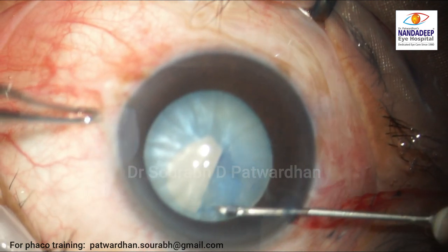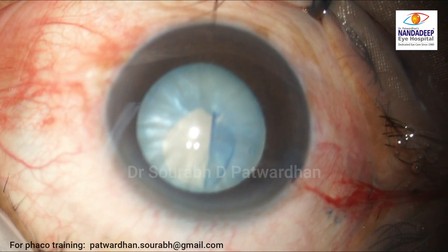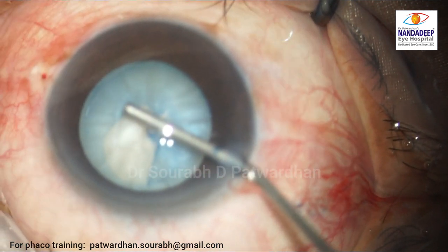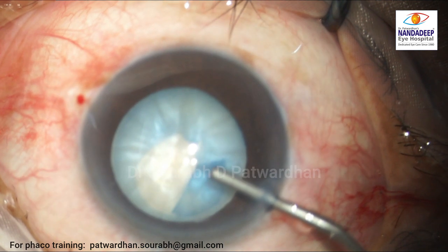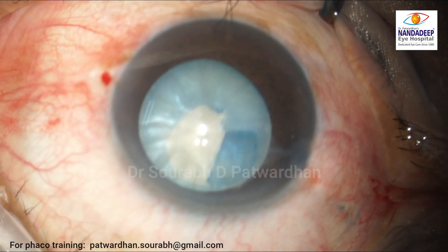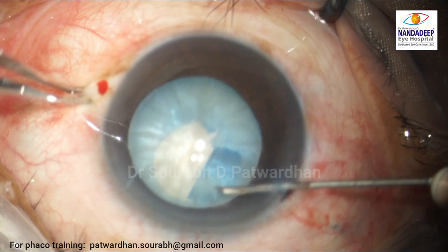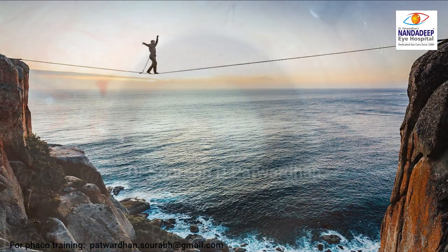The surgeon continues on this path. A good way to fill viscoelastic is to go beyond the rhexis margin and push fluid in — this will flatten the anterior capsule. Don't push the viscoelastic at the incision to start with.